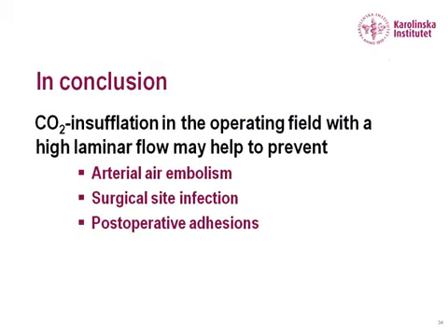So in conclusion, CO2 insufflation in the operating field with the high laminar flow may help to prevent arterial embolism, surgical site infection, and post-operative adhesions.